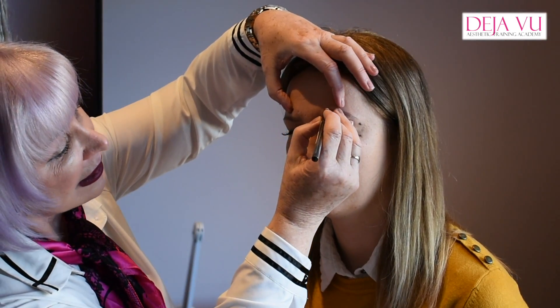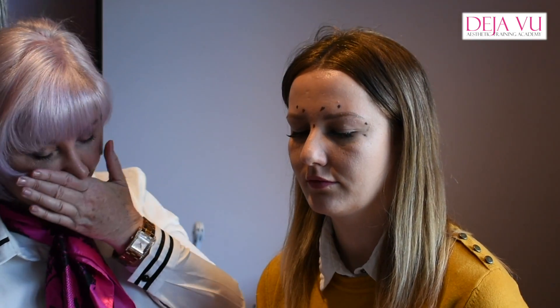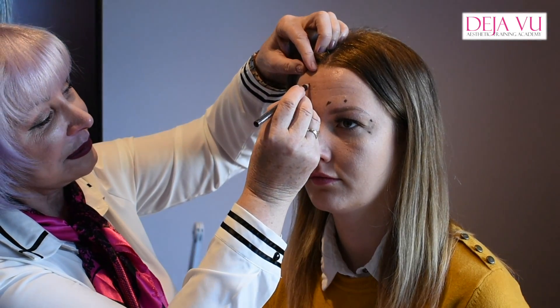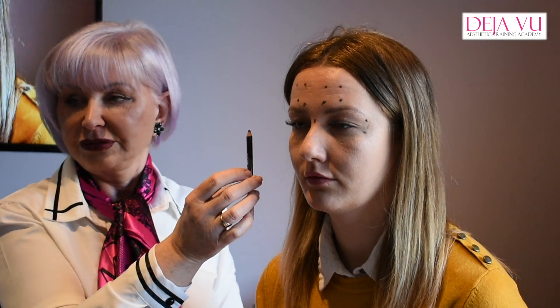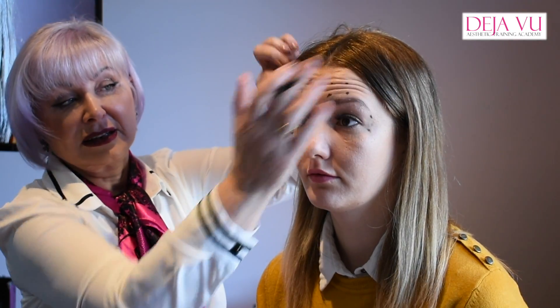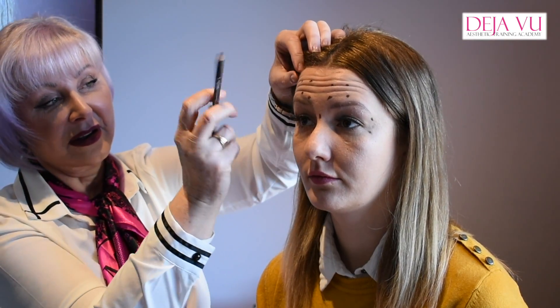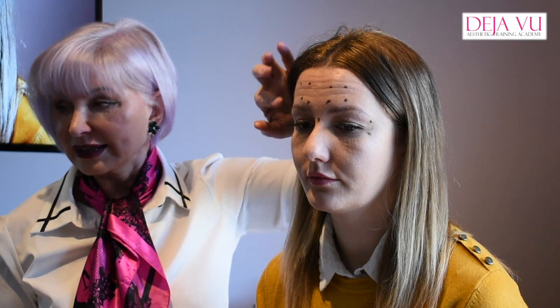Just about a finger height above the eyebrow — one in the middle there, and then in the belly of the muscle, just there. Can you try to raise your brows for me? Sophie's lines come right the way across. If you relax, follow these up first of all — you're in the magic box. You don't need to go past mid-pupil; you know then that you're safe and you're not going to get a ptosis. But because she's got these lines here, if you don't inject up here and lift them up, all this area is going to remain still and she's going to get that pull — like devil's horns. So what you need to do is follow the pull there, and then put five units in, nice and high. It won't give a ptosis, but it will stop those lines forming.